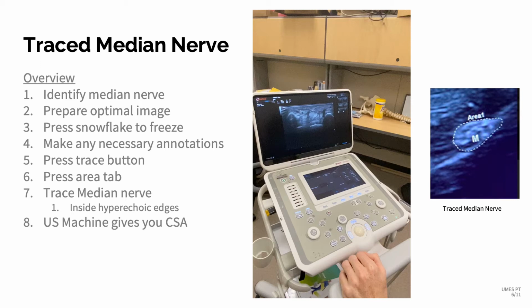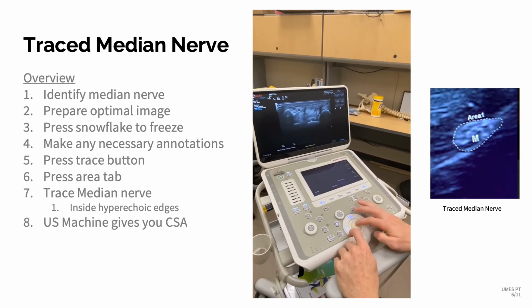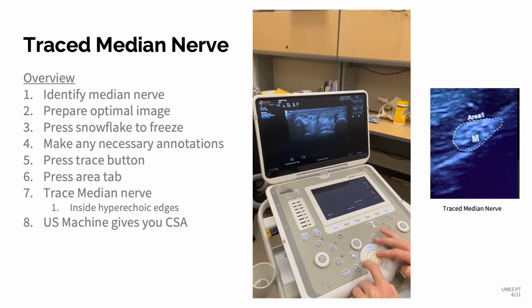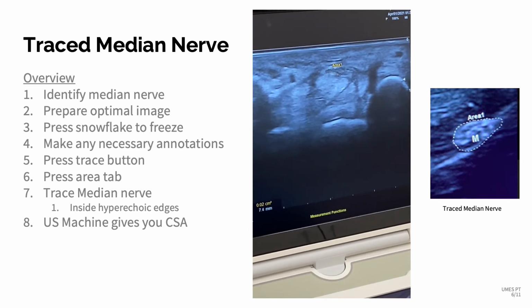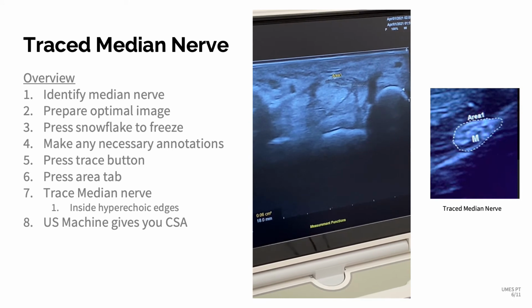So let us watch this video. He presses the trace, then he clicks when he gets the nerve and he's tracing around it. He's doing this pretty fast, but he's had some practice.